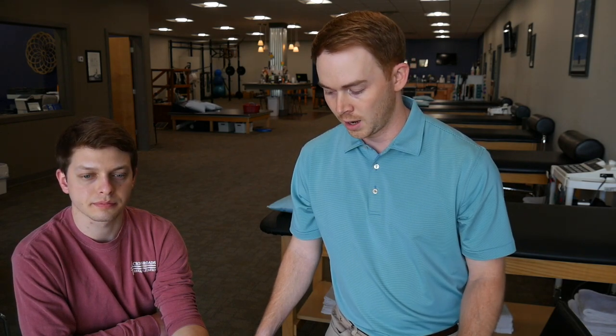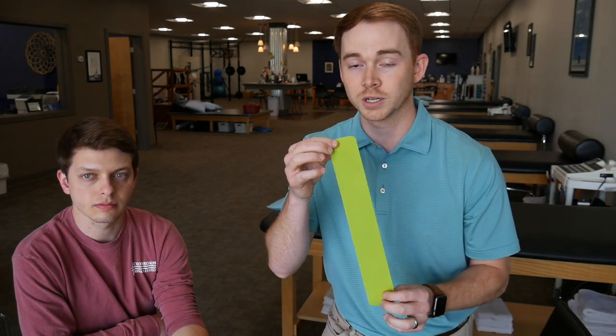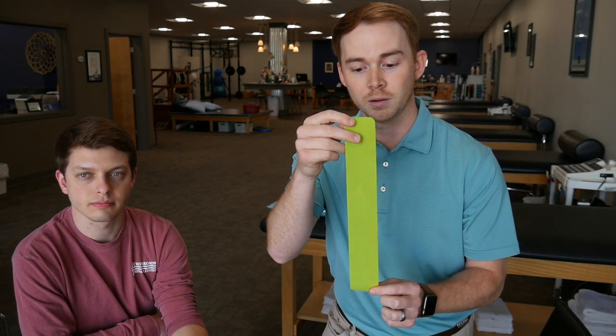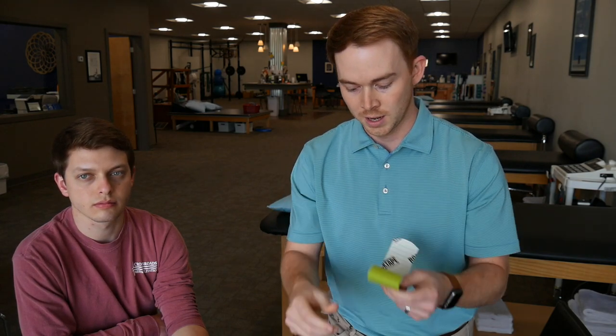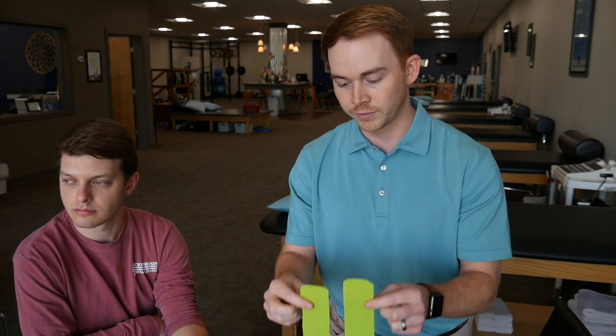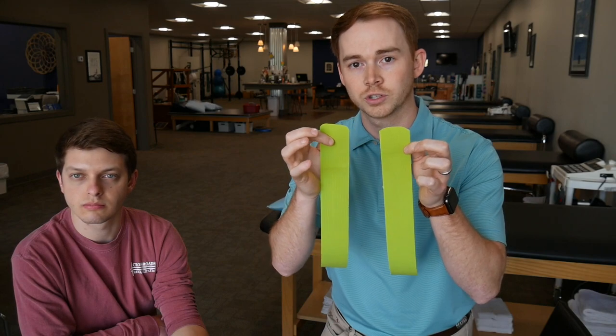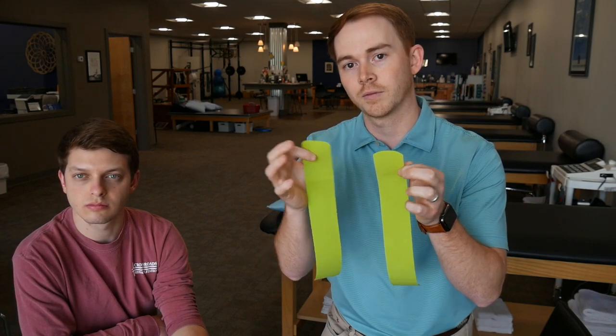My wife's a pediatric OT and she talks all the time about having to tape to facilitate wrist extension in babies who have suffered a brachial plexus injury, more specifically something like Erb's palsy. So for the pediatric population, especially babies, you can get away with using just one strip here. For an adult size hand and just for the purposes of this video, I'm going to have to do it on two separate ones. So just know that when you're taping for a baby versus an adult.